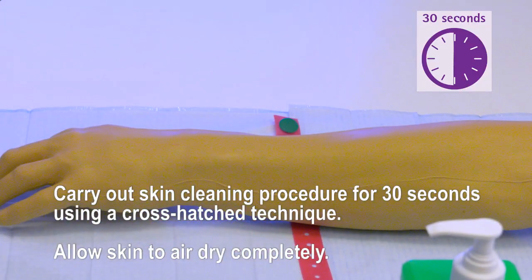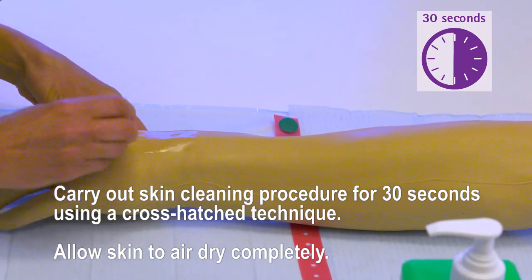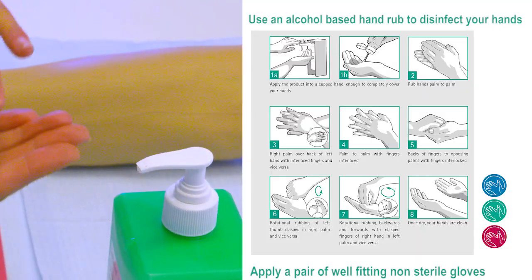Carry out the skin cleaning procedure for 30 seconds using a cross-hatched technique. Allow the skin to air dry completely. Alcohol gel your hands and apply a pair of well-fitting non-sterile gloves.